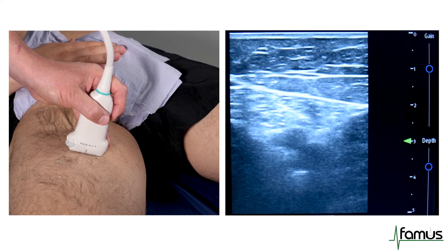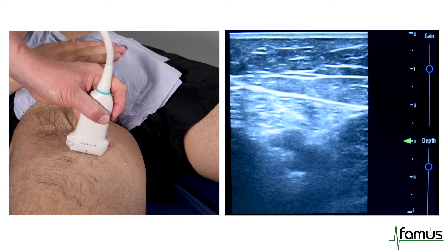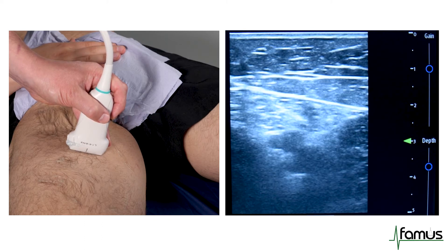This rules out the presence of thrombus at this point, and so I'm going to move on to the third point, which is in the popliteal fossa behind the knee.